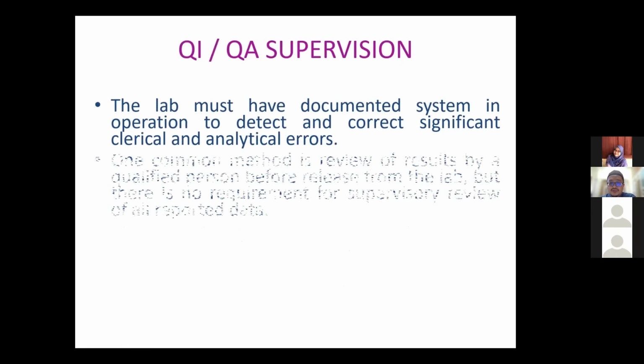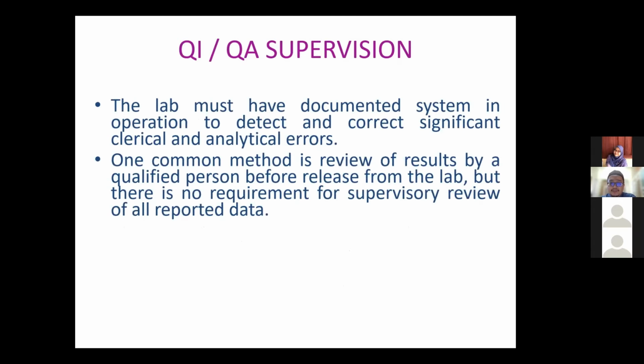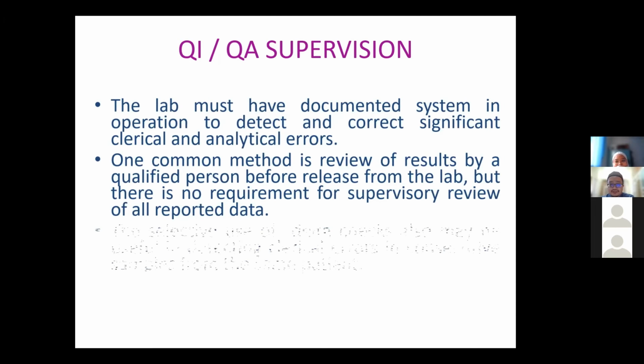Lab must have a documented system in operation to detect and correct significant clerical and analytical errors. One common method is review of results by a qualified person before release from the lab, but there is no requirement for supervisory review of all reported data. So it's up to the lab themselves, yeah, to have the timetable, the schedule to do the QI and QA. Okay.